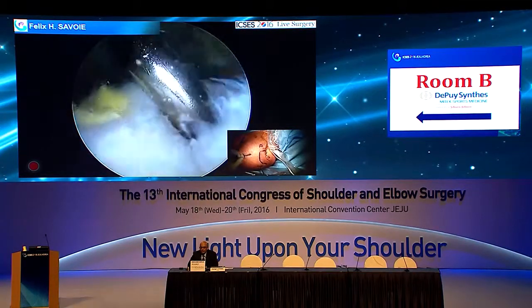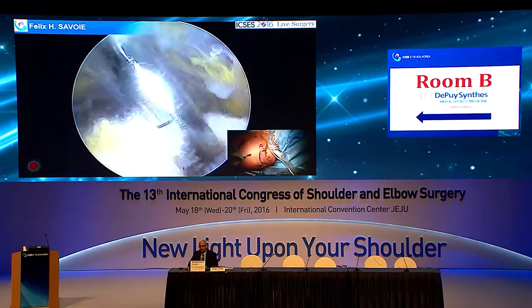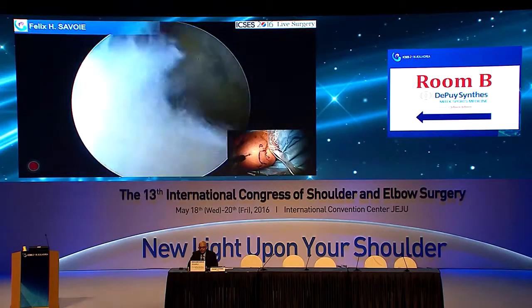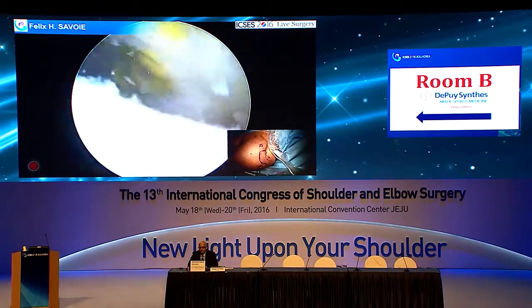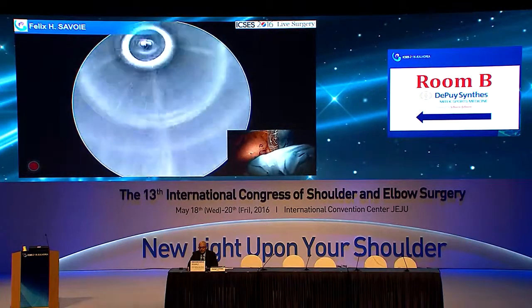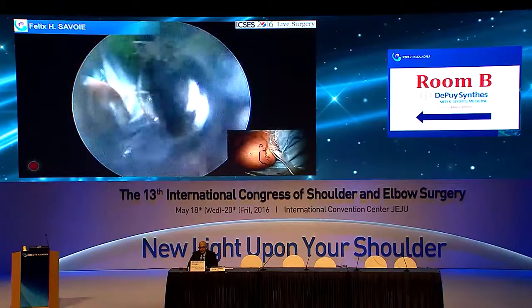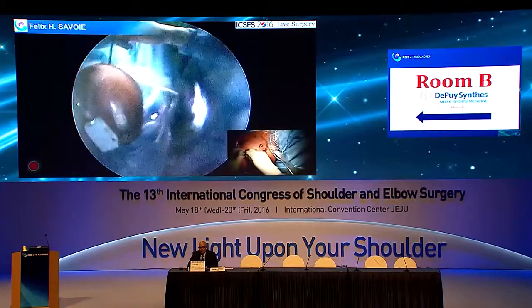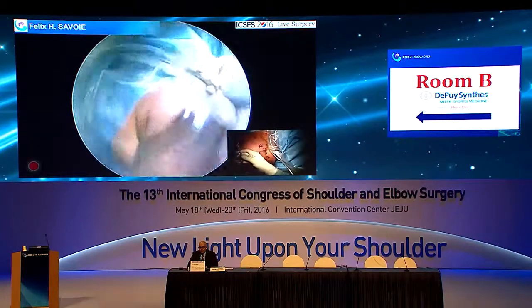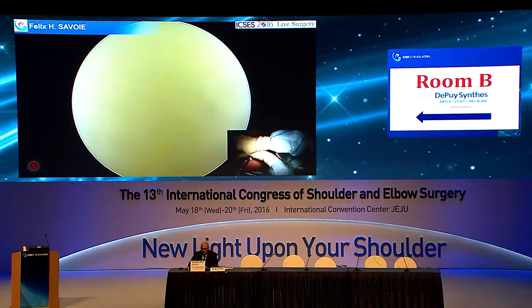So here's our cuff, and we'll clean up the greater tuberosity a little bit, and we'll make some trephination holes in a minute with our awl. So then we're finished with this part. So normally then, you're going to move your scope to the lateral portal, and you would come in from the back and clean up and see what your angles are for fixing this in terms of how we're going to pass our sutures.